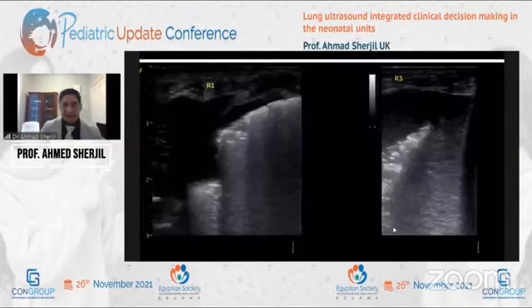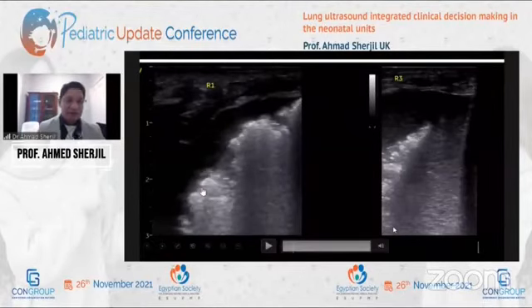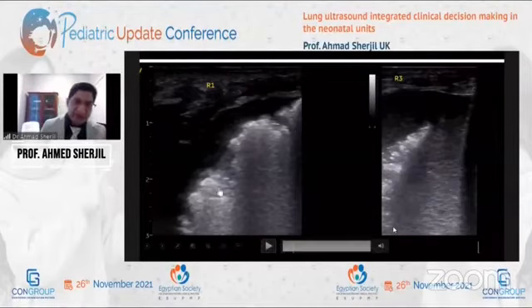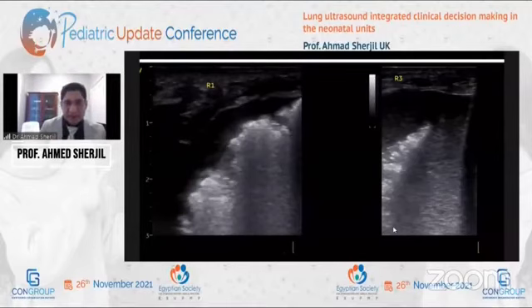But if you look at the scan, it tells you a far more detailed and far more accurate account of what's going on here. So this is a costophrenic angle on the right side, and what you're seeing is a shredded pleura, where the subpleural echogenicities are more dominant than the pleura. There's no pleura here. It's so damaged, and the echogenicities are so hyperechoic that I'm sure it will remind you when I said white is for blood, clotted blood.